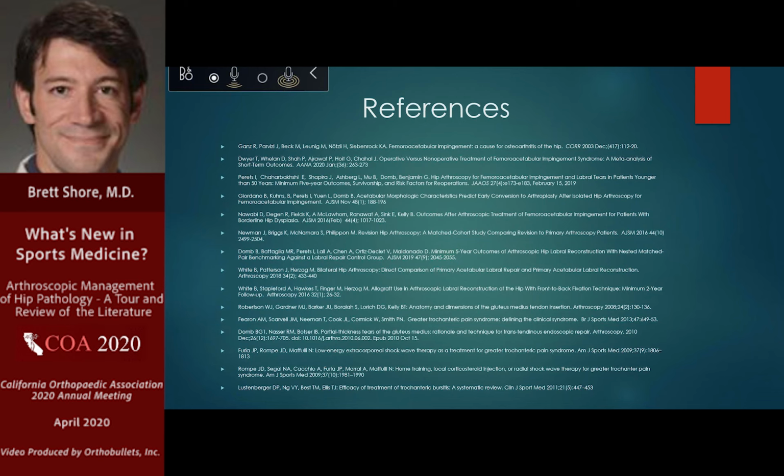It's a really good question, Dr. Banfi. And to be totally honest, it's still something I go back and forth with. I think the problem we have in hip arthroscopy is that we haven't been doing it long enough to be able to prove what we think we already know, which is that this helps prevent arthritis. We do this operation for two reasons. One, for the short-term symptomatic relief, and two, for the long-term prevention of hip degeneration.